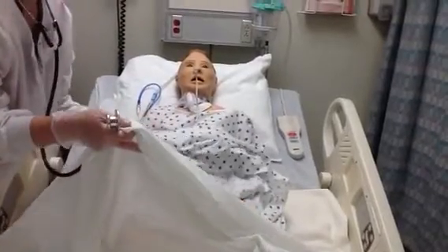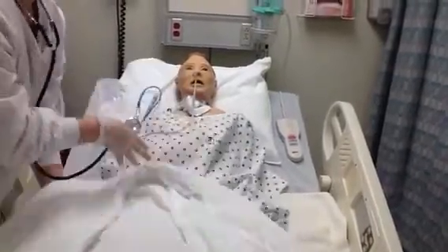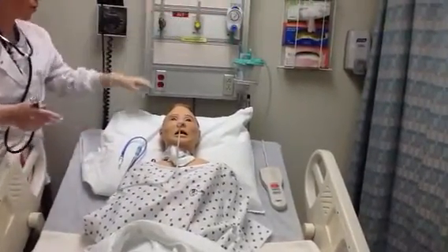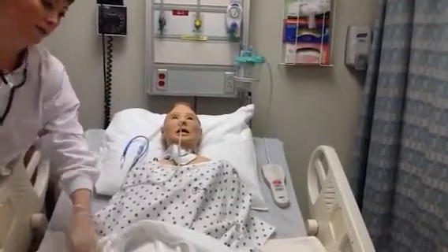Once you are done inspecting, auscultating, and palpating, you would then come back and turn your suction back on to either regular or intermittent, depending on what is ordered by the physician.